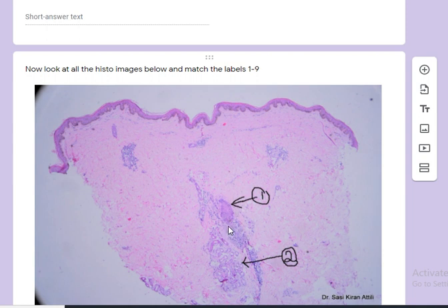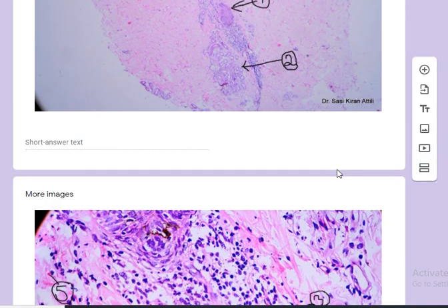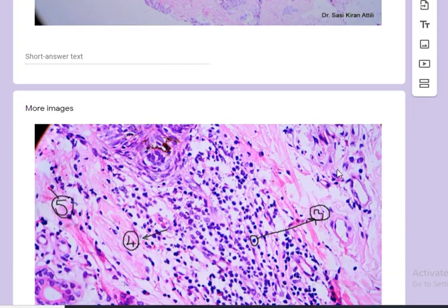You can see a sort of lichenoid infiltrate around the hair follicle remnants. So number one is a hair follicle, number two is the sweat glands in the deep dermis, and here you're seeing some patchy infiltrate. The collagen here appears quite homogeneous and a bit sclerosed. You can even make that out on low power, and typically on low power you have this typical squared-out punch biopsy. Okay, so this is typical of morphea even on low power.